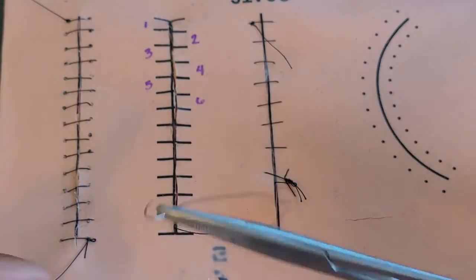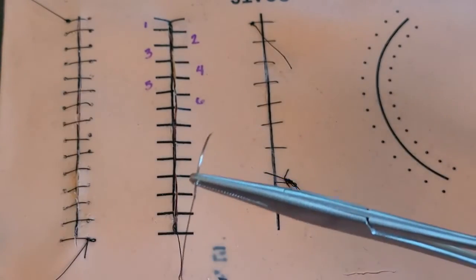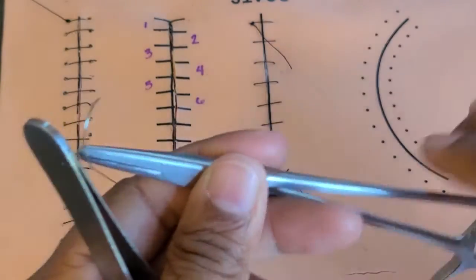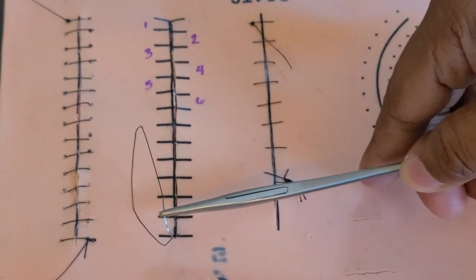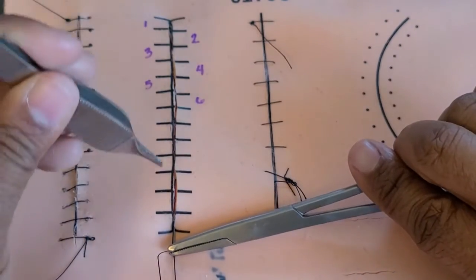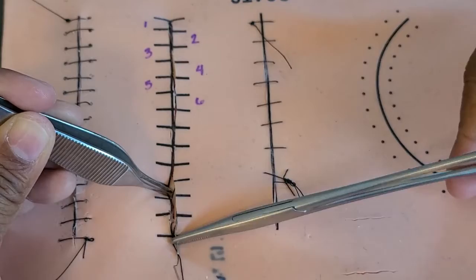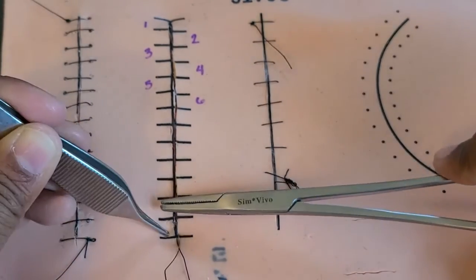Once you get to the very end of your incision, you're going to backhand load your needle. You're going to start from the apex and go through your epidermis and subq.